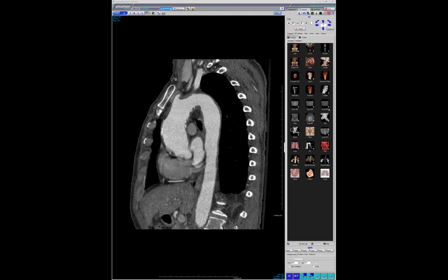Yeah, I've never seen the case. So I was really happy it popped into my mind, and I'm like, let me just type this in. And sure enough, I was like, no way. I actually, believe it or not, remember David showing a case a couple of years ago, and it had this bulbous, weird morphology.